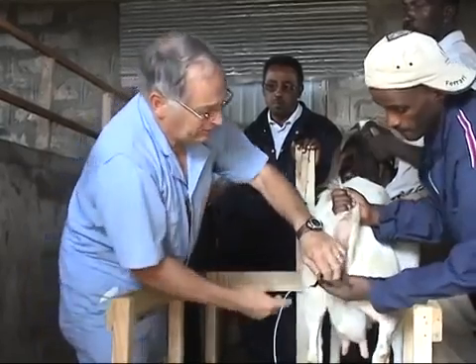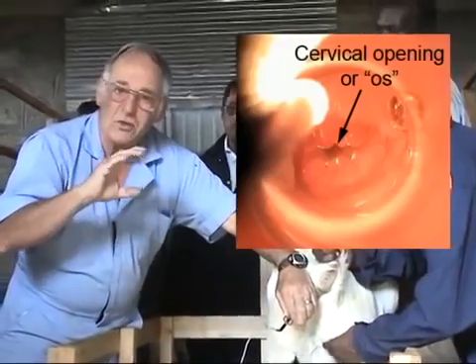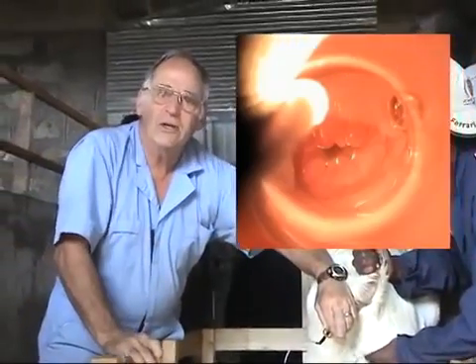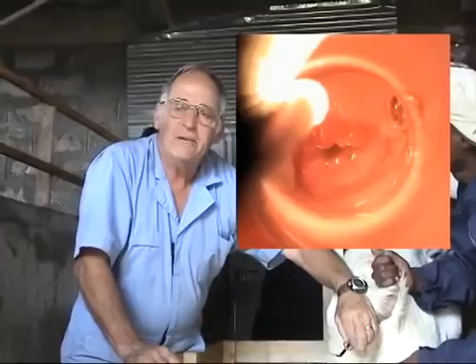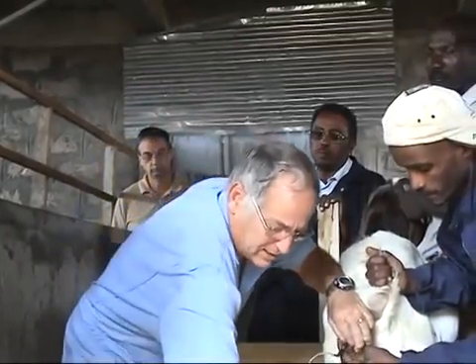Right now I'll look at the mucus and see if I can locate the entrance. What you want to look for is the cervix and whether it is open, because if it's open it's usually a pretty good indication that she's in good heat and it allows for easy penetration using the gun to deposit the semen. So I'll load the gun at this time.